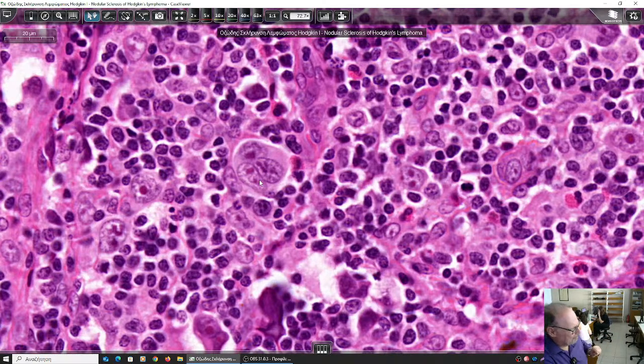Yes, please. Yeah, they are lacunar. Look, I'm the first one who saw. Nobody in the literature has seen that. So what do you think they should be called? Please pay attention to what you say.